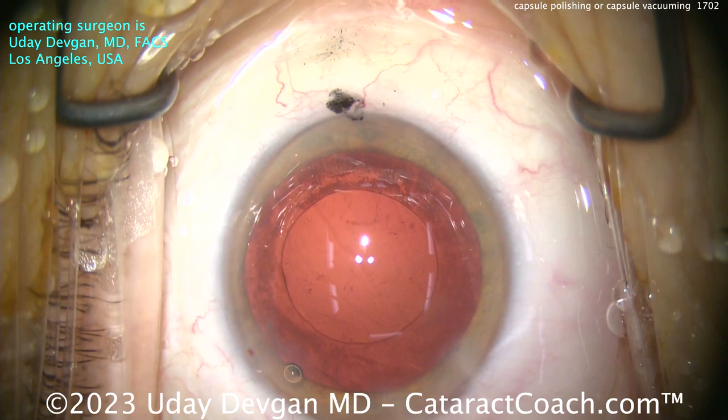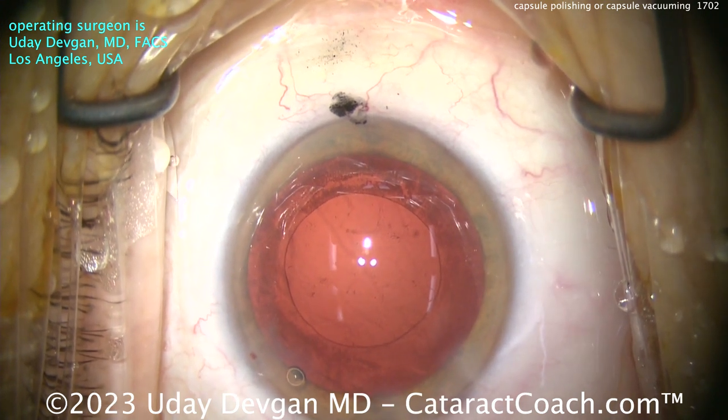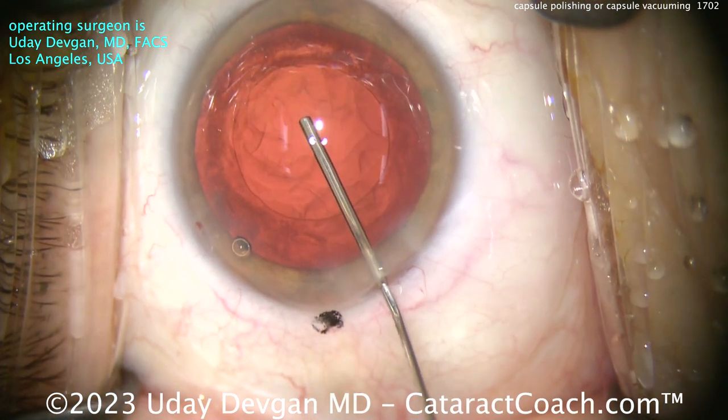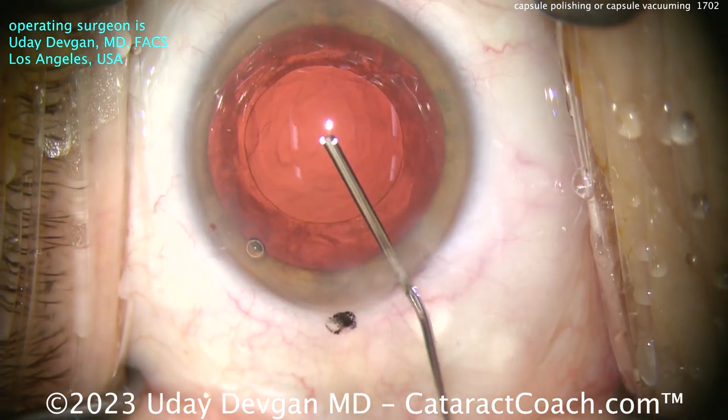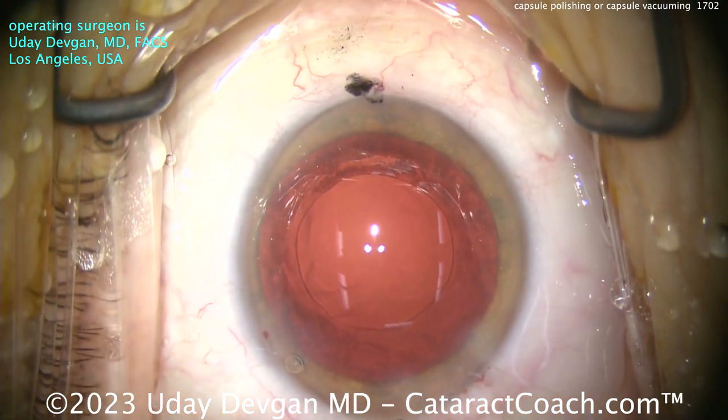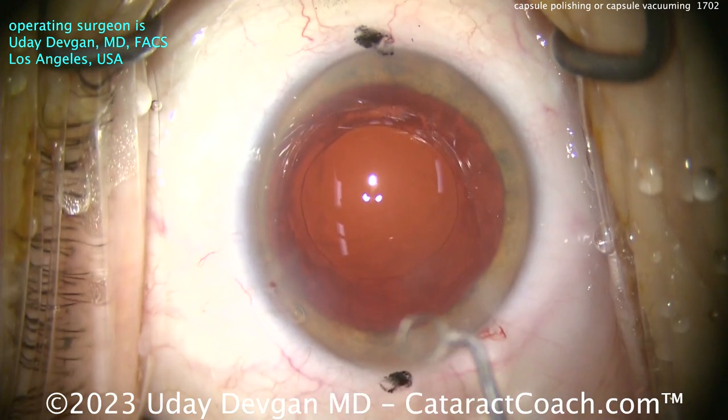There have been studies one way or the other — showing you should remove it, you shouldn't remove it. But I can understand it'll decrease the inflammatory burden on the eye. So let's fill the capsular bag with our cohesive viscoelastic. Nice big capsular fill, reasonable-looking rhexis axis — I'll take it. Now let's clean it up.